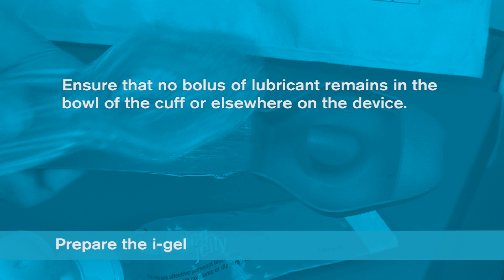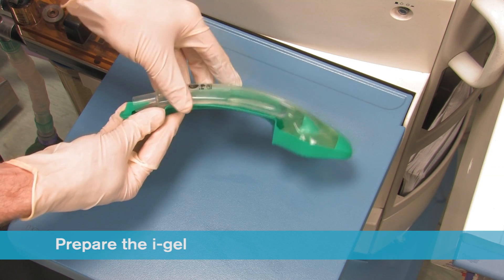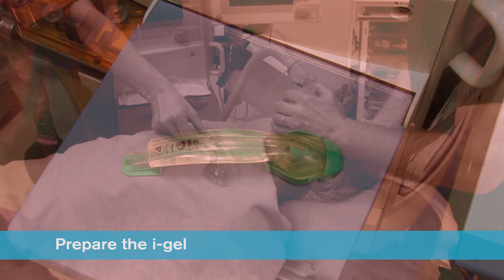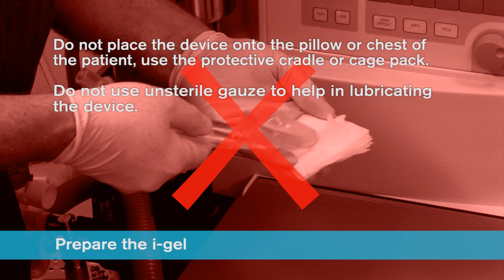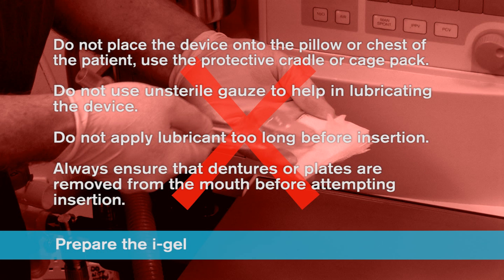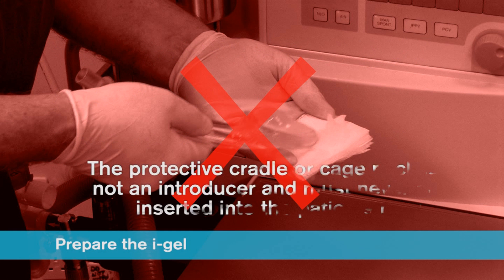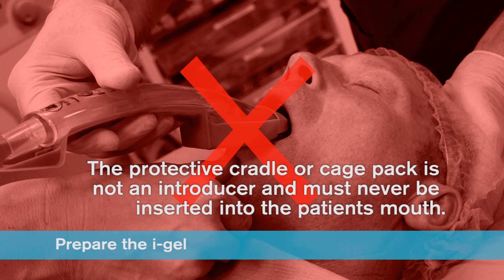After lubrication has been completed, check that no bolus of lubricant remains in the bowl of the cuff or elsewhere on the device. Avoid touching the cuff of the device with your hands. Place the iGel back into the protective cradle or cage pack in preparation for insertion. Do not place the device onto the pillow or chest of the patient. Always use the protective cradle or cage pack. Do not use unsterile gauze to help in lubricating the device. Do not apply lubricant too long before insertion. Always ensure dentures or plates are removed from the mouth before attempting insertion. The iGel must always be separated from the protective cradle or cage pack prior to use — these are not introducers and must never be inserted into the patient's mouth.